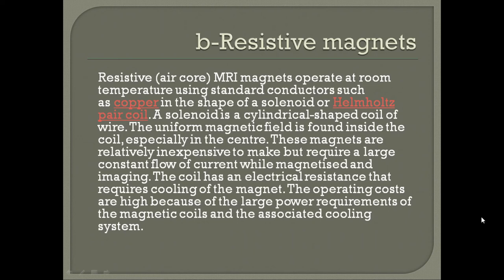These magnets are relatively inexpensive to make, but they require a large constant flow of current while magnetized and during imaging. The coil has an electrical resistance that requires cooling of the magnet. The operating costs are high because of the large power requirement of the magnetic coils and the associated cooling system.